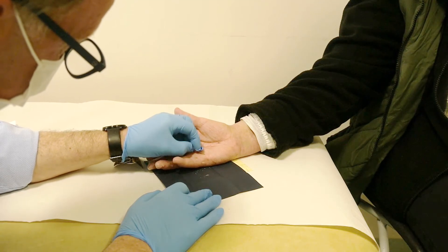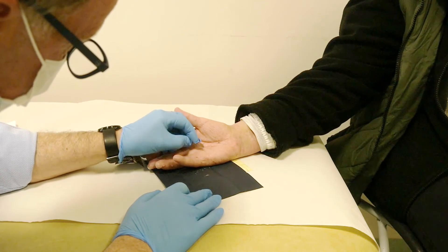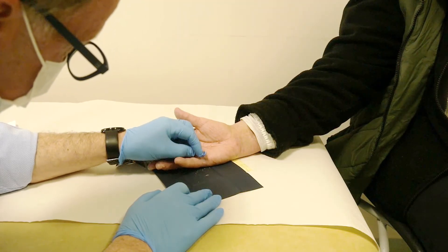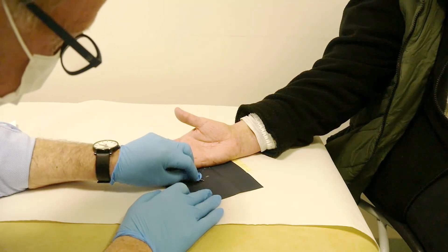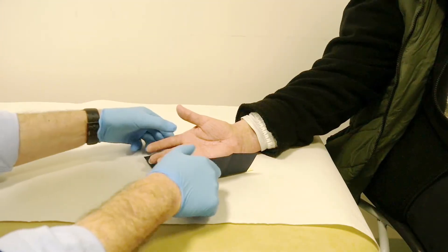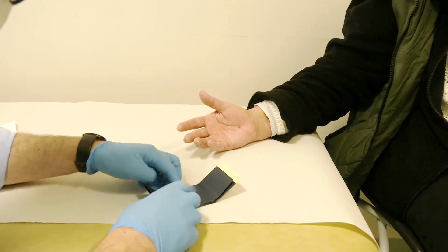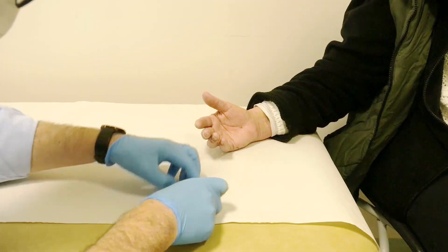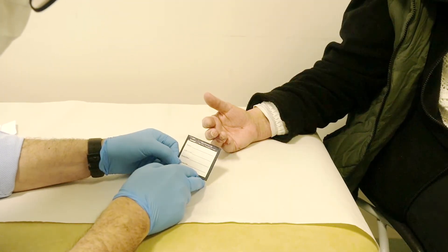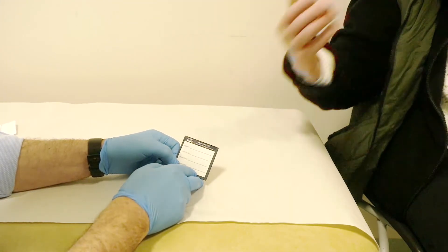It's useful to have black paper available as this allows the lab to identify the scale easily, but it's more important to take the specimens and put them on white paper than not to take any specimens at all. The more scale collected, the better the diagnostic accuracy and yield.